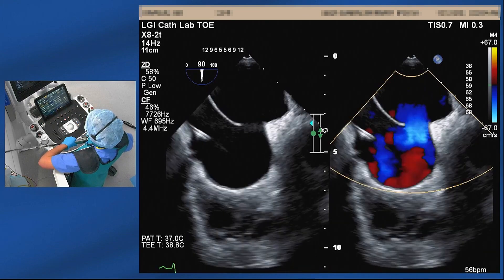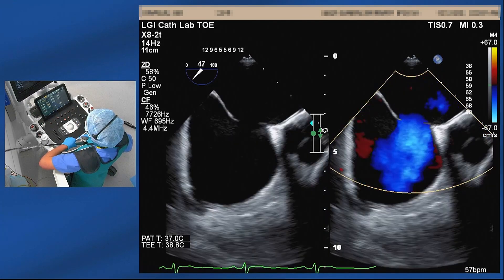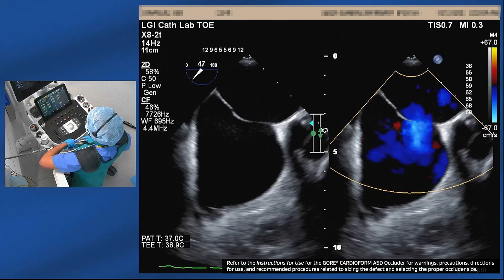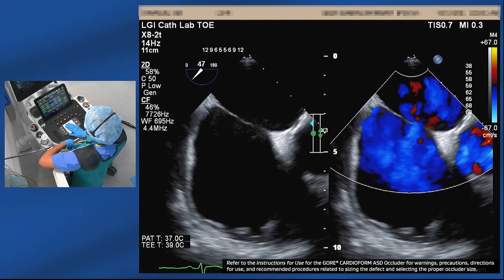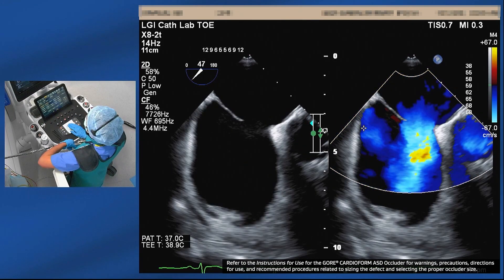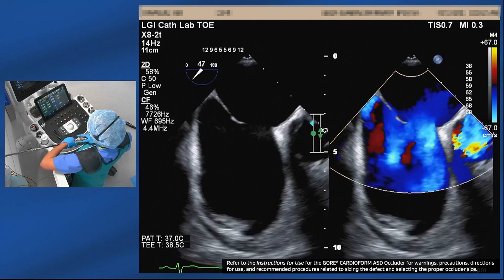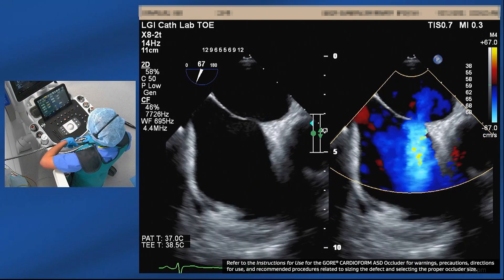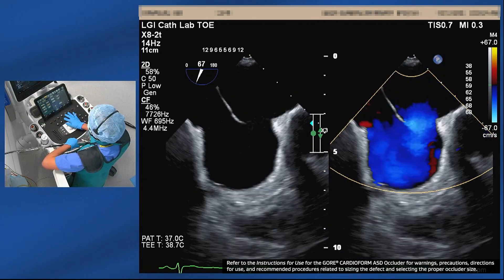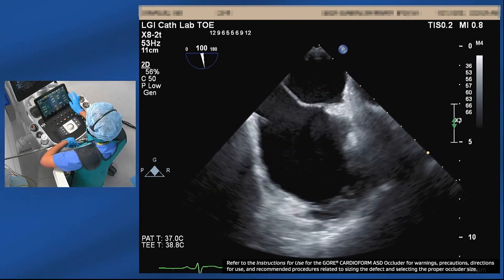It's about 15 millimeters here. The maximum dimension we had approximately in the 40 to 50 degree view was about 16 to 17 millimeters. Once we have a good feeling of the rims and the size of the defect, it's good to see it on 3D.